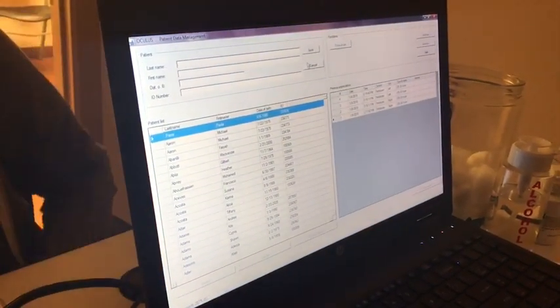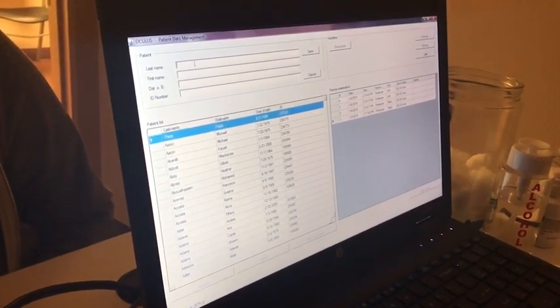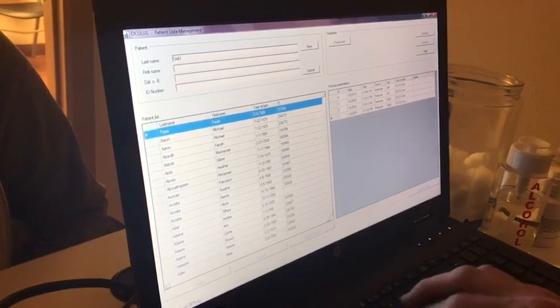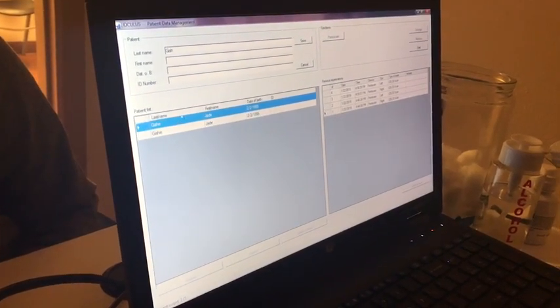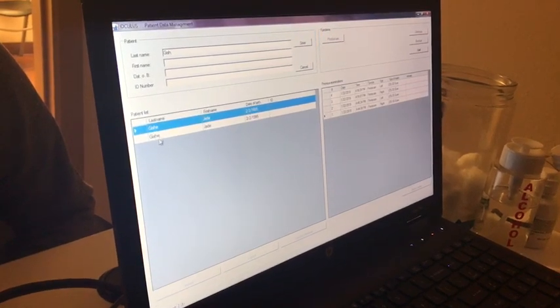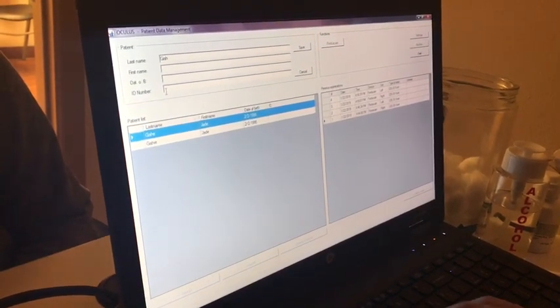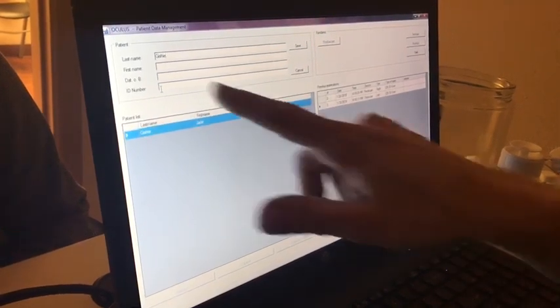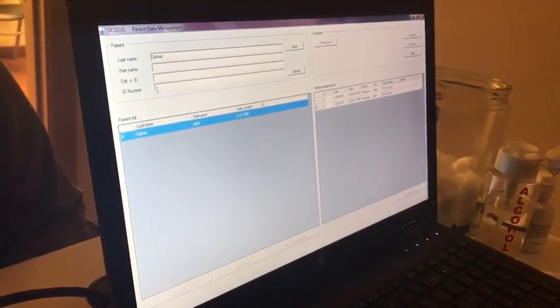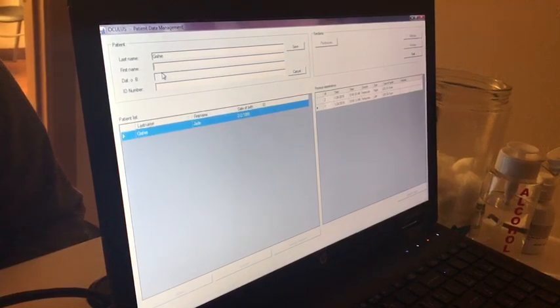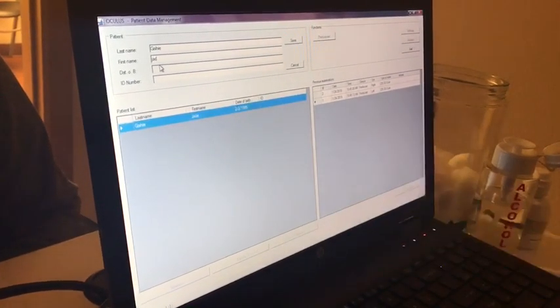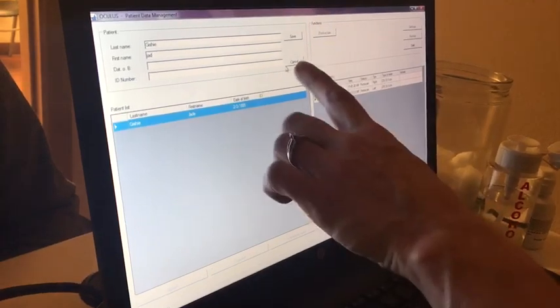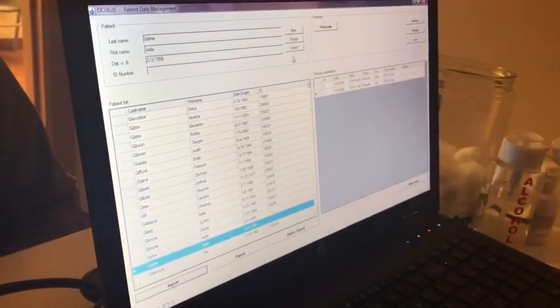Under last name you're going to hit new. Even if they're old you just still hit new. Type in the first part of the last name. Once you start to type it in it's going to highlight the patient that is yours. If you need to put in the first name to find it also you can do that. But once they're highlighted, you've got your patient, then you go over here and click cancel. And now it loads all of our information in there.